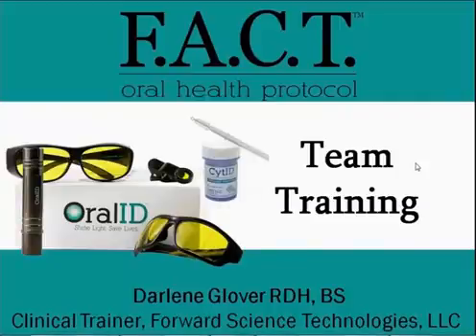So I'm going to cover everything that you will need to know as far as how to use the device, how to maintain it, how to implement it, and then the biggest question that the clinical staff has is what are we looking for? And so we'll go through several case studies.